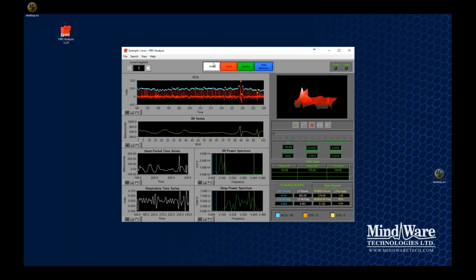Okay, so to demonstrate that, I clicked Analyze, which brought us to the analysis screen. And this is where we're going to see the transformation that we take from ECG to our statistics represented here in these various waveforms. And this is also where we're going to be seeing the point distribution, the points that are flagged as good versus a potential artifact. And we're also going to enter the ECG editor from this screen to actually do our edits.